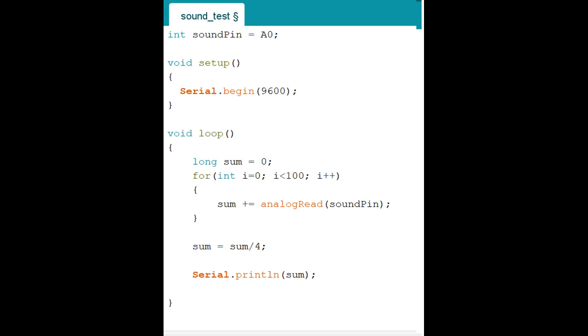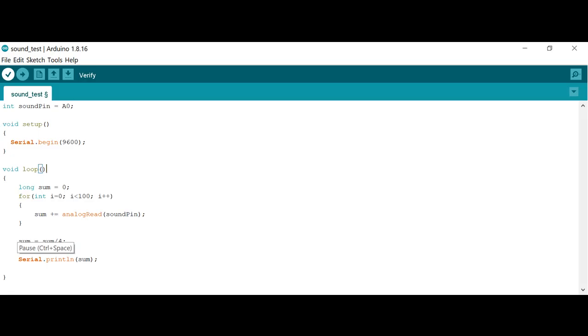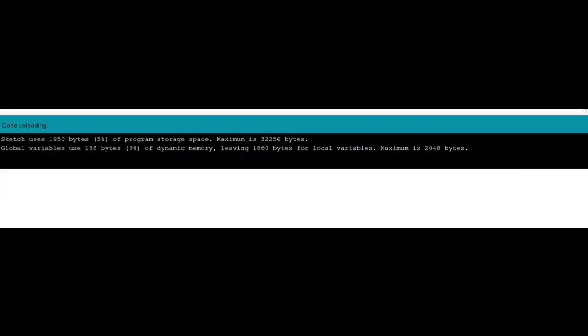Now what you need to do is save again so you don't lose anything. Then look at the top left corner, you see the check mark. Click that check mark and you will compile your code. After compiling is done, you will see a green box at the bottom of your Arduino coding window, and it says compiling is completed. When you see that message, you are all done. Now on the top of your Arduino window, next to the check mark, you see the arrow. Click that arrow and it will upload your code to the Arduino. After it is done, you will see a successful message at the bottom of your Arduino window. When it says completed, you're done.